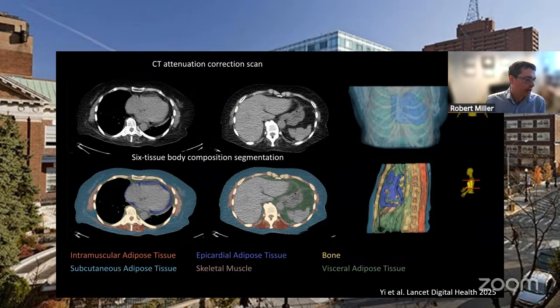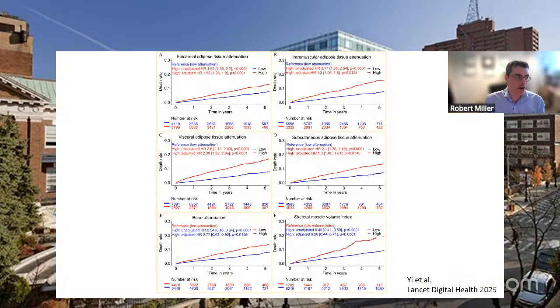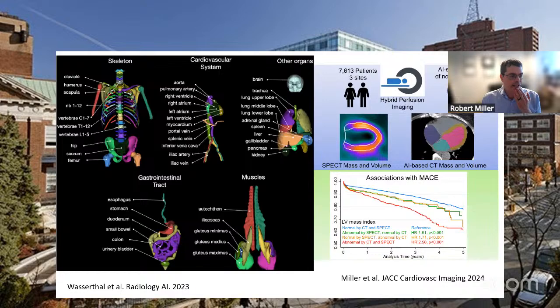The other things that are interesting to come out of this are skeletal muscle volumes and density are quite important, as well as bone volume and density. Like I said, a lot of this was built off of the network that was created for TotalSegmentator. I want to talk about this a little bit because it was trained in a really interesting way.